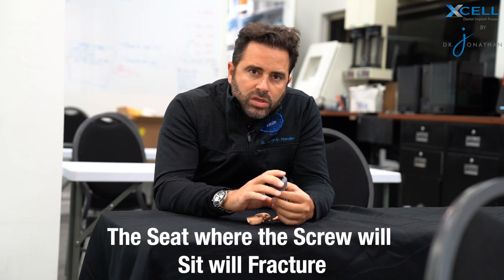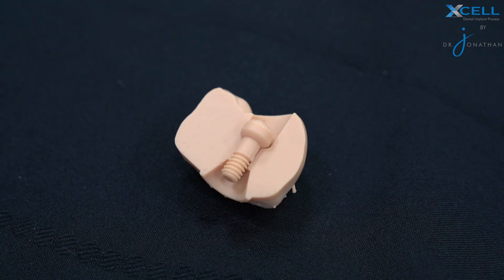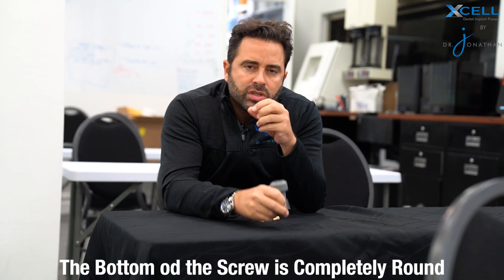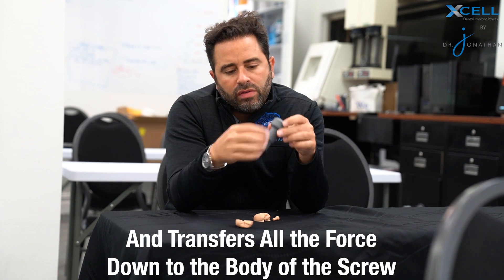When you use a traditional titanium screw and put it into a zirconia or PMMA prosthesis, what typically happens is that the seat where the screw sits will actually just fracture. So what we did — if you look closely at this section right here — we created a rounded edge, which is why we call it the Powerball. The bottom of the screw is completely round, and because it's round it creates very gentle forces to the zirconia or the PMMA, transferring all the force down to the body of the screw and not into the body of the prosthesis.